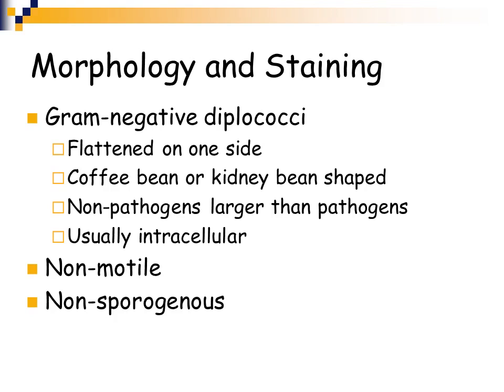Commonly, they are found intracellularly in a clinical specimen, so in a spinal fluid or in a male urethral discharge, you will see a lot of white blood cells, and you'll see the gram-negative diplococci both intracellularly and extracellularly. These are non-motile organisms. They do not form spores.